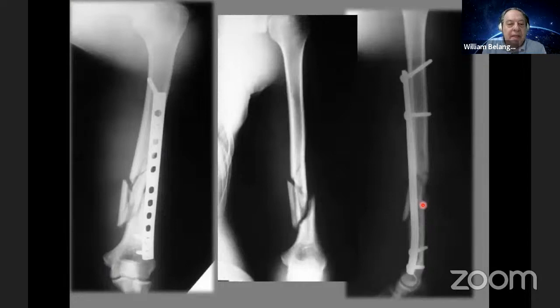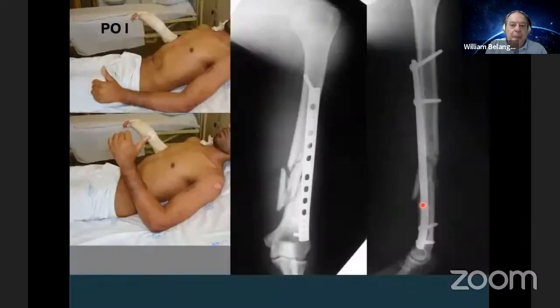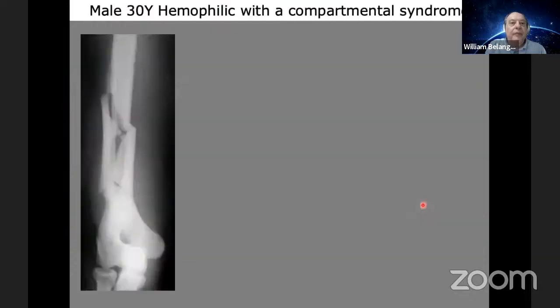And then this is the X-ray after this procedure. AP view, lateral view, you see. Radial nerve, it's okay. We don't see the radial nerve during this procedure. This is the fracture at 12 weeks, very good bone healing. Okay.